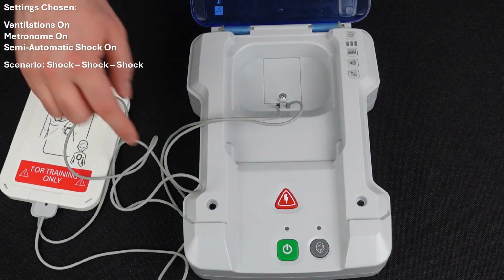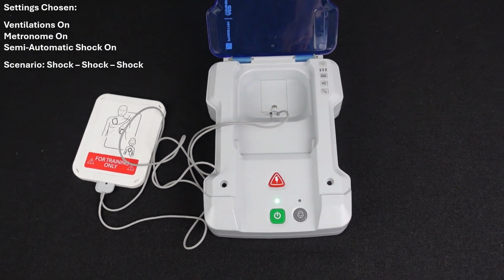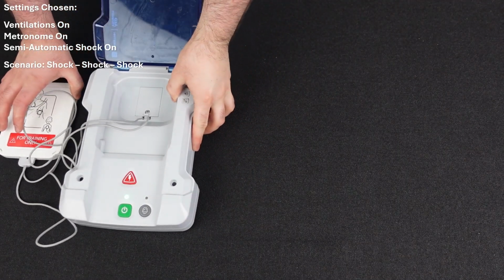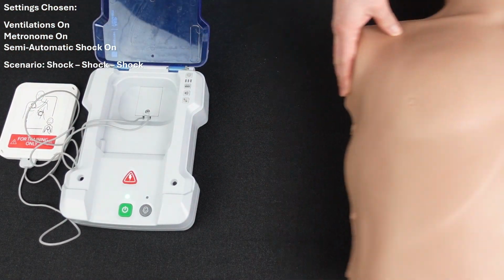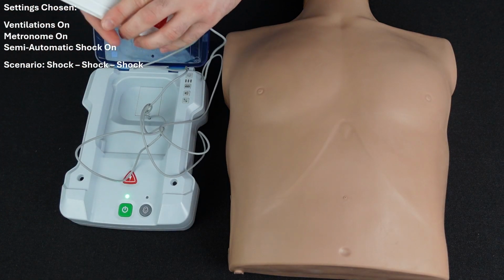Now that we know how to set up the AED trainer, let's go over how it will be used in the classroom. First, turn on the AED trainer. If practicing on a child mannequin, click the child button. Follow the prompts as stated by the AED trainer. To start, remove any clothing from the training mannequin where you will be placing AED pads or doing compressions. You will then remove the AED pads from their storage case.